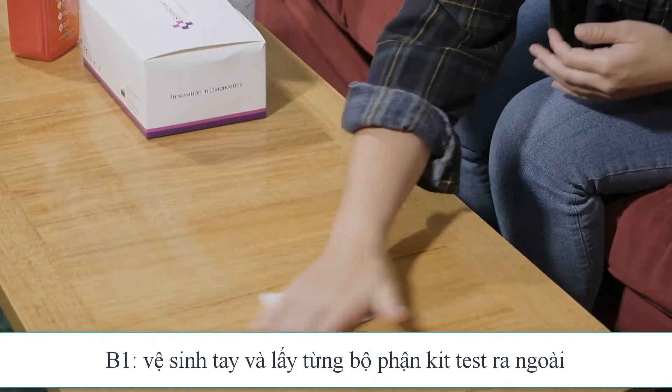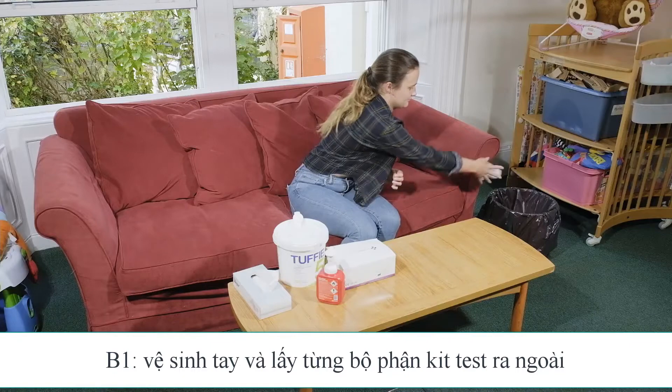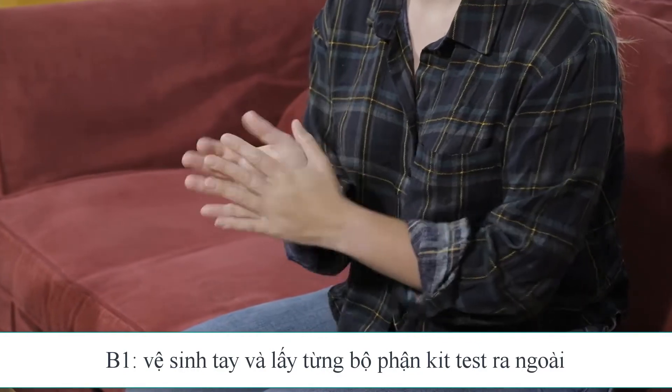Prepare a clean, flat surface, ensuring it is clean and dry and can't be reached by children or pets. Apply a hand sanitizer or wash your hands before preparing your equipment.